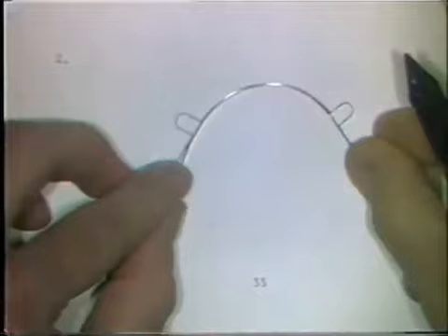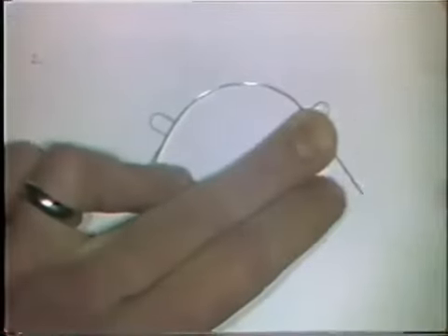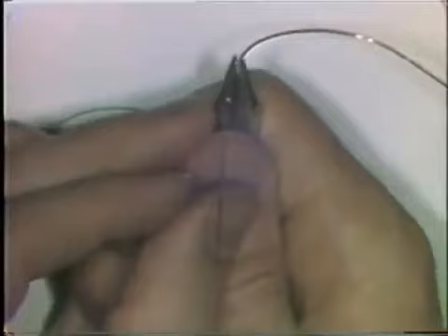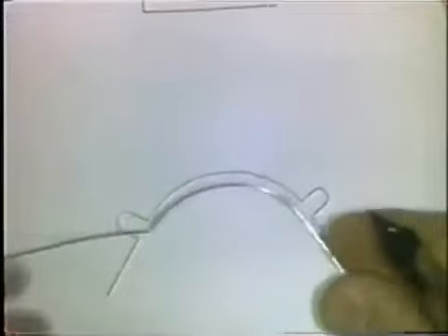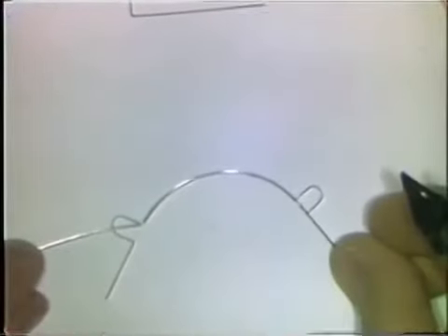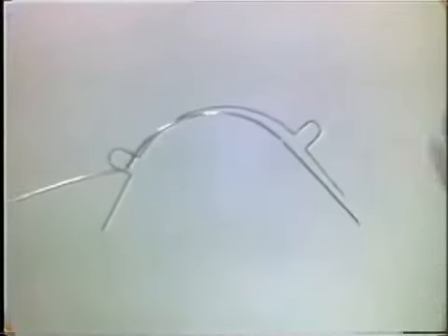You form the loop by marking the spot where the first 90-degree bend should be made. You place the wire in the beaks of the plier so that the flat plane of the curve that you formed is at directly 90 degrees to the plier beaks. You want this first leg of the loop to be in the same plane of space as the curvature. You bend the wire about 30 degrees. Try it on the pattern to see if you've located your bend in the right spot. And then you check the flatness of the wire.